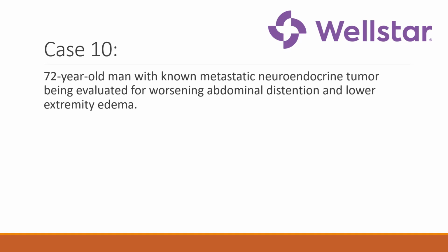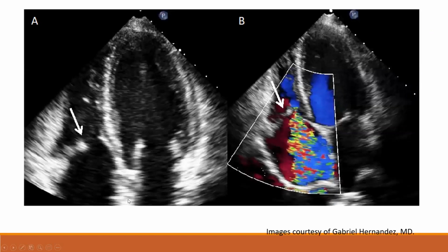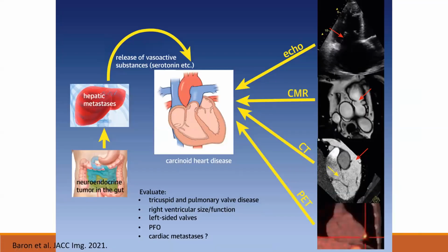And moving on to our 10th and last case, this is a 72-year-old man with a known metastatic neuroendocrine tumor being evaluated for worsening abdominal distension and lower extremity edema. This patient has certainly significant tricuspid regurgitation in the setting of carcinoid heart disease. So what is carcinoid heart disease? It's a condition where a patient has a neuroendocrine tumor, the carcinoid tumor, which releases vasoactive substances, which can then affect multiple areas of the body, but on echocardiography, most commonly affect the right-sided heart valves.